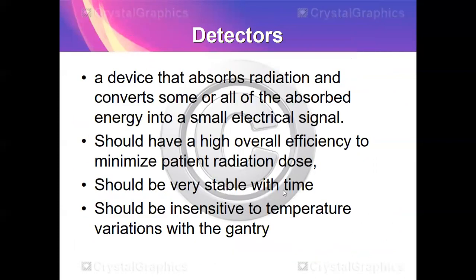Then, for detectors, na-mention natin to before, a device that absorbs radiation and converts some or all of the absorbed energy into a small electrical signal. So, ang purpose ng detector, ito yung nagsisilbi nating image receptor.